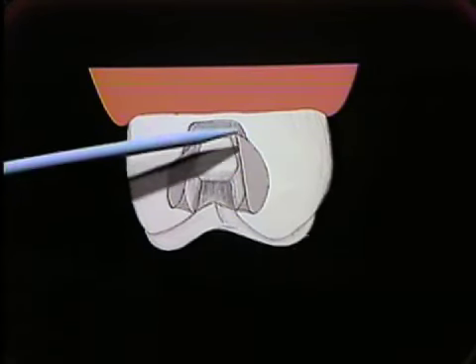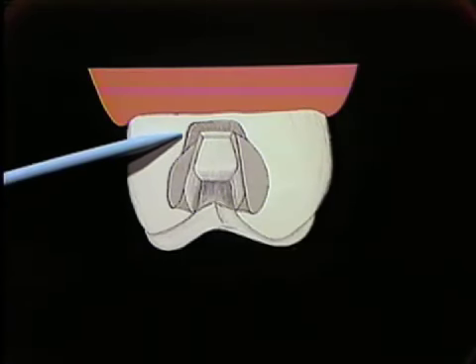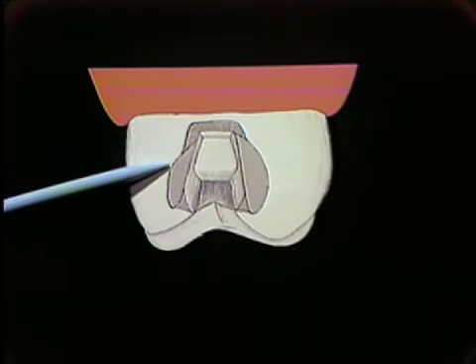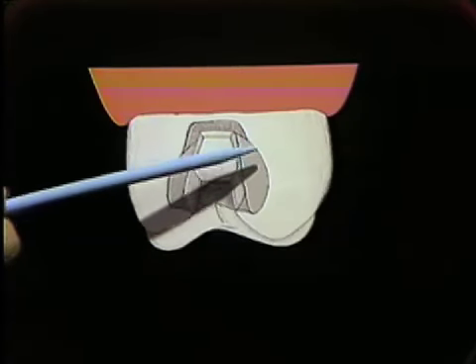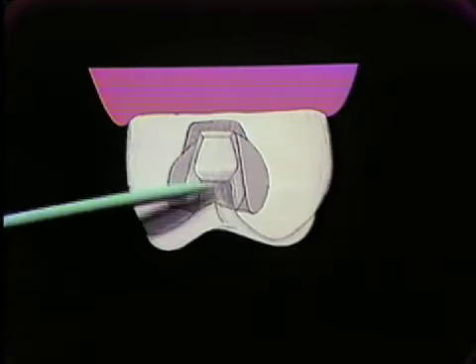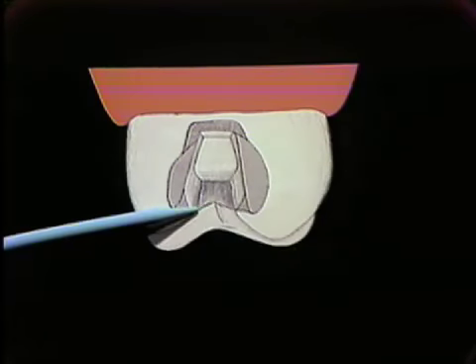You will note then, too, that the cervical bevel connects up onto the slice, a millimeter, millimeter and a half, across the whole cervical, and then up onto the slice again onto the buccal, making it one continuous flow for this cervical finish line. Please note also in all of these slice preparations the beveling of the entrant angles.